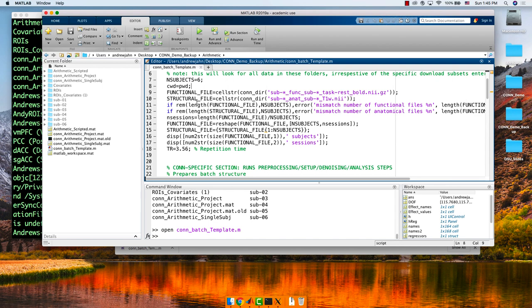The most important settings you'll probably change are N_subjects and TR. Let's say I just discovered that the TR is actually something different and I want to rerun my analysis without doing it all manually. In this case, I can select and change my repetition time, TR, down to 2.1. Before analyzing all six subjects, I'll leave that as is for now.